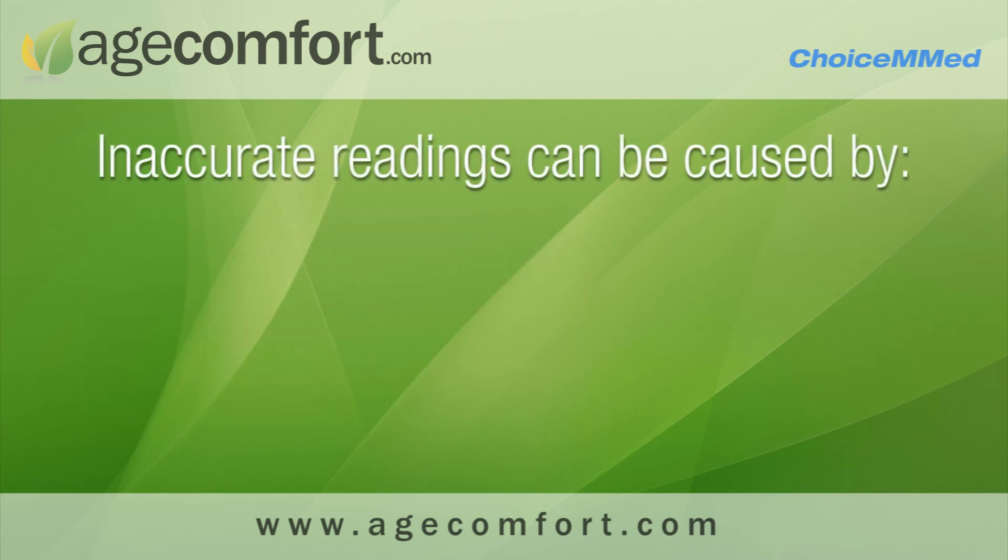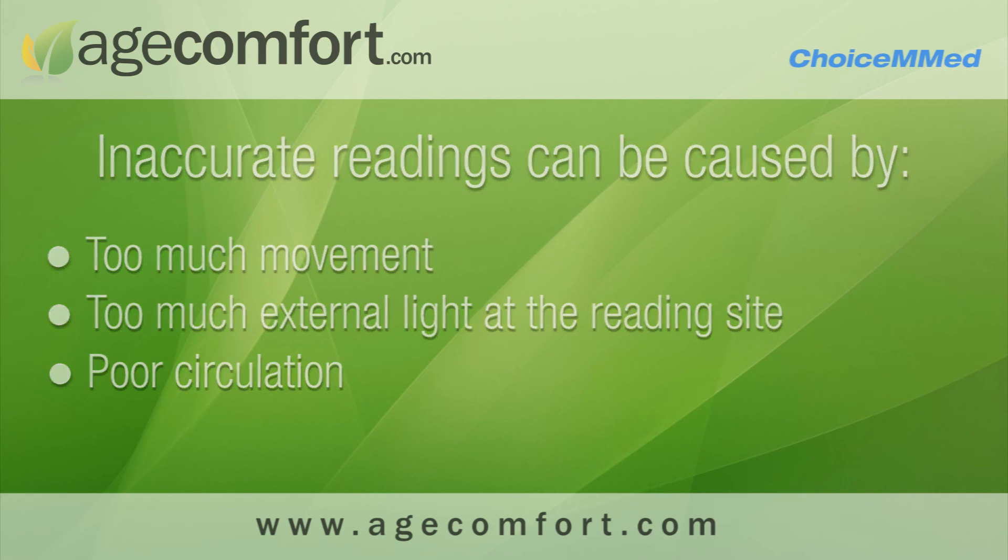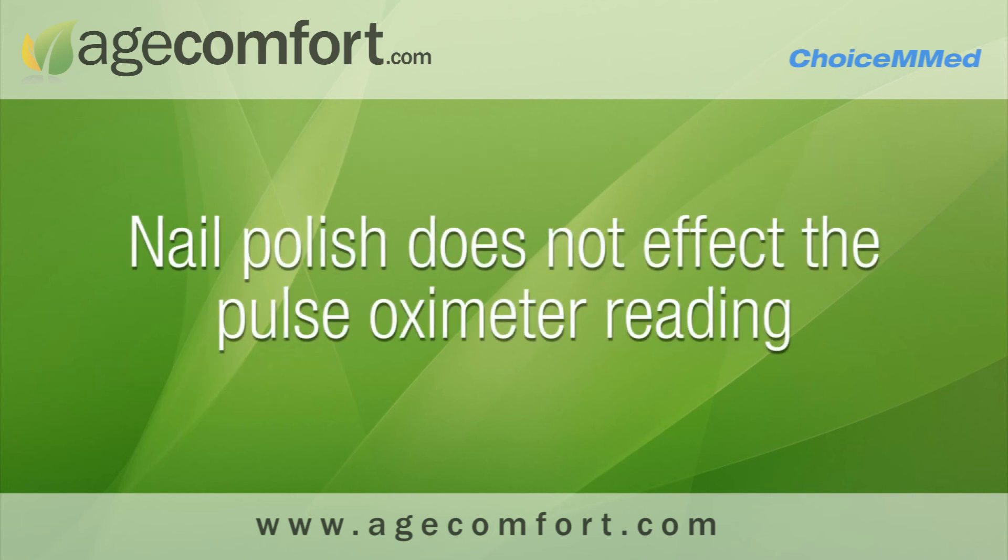Inaccurate readings can be caused by too much movement, too much external light at the reading site, or poor circulation. Wearing nail polish does not affect the pulse oximeter reading.